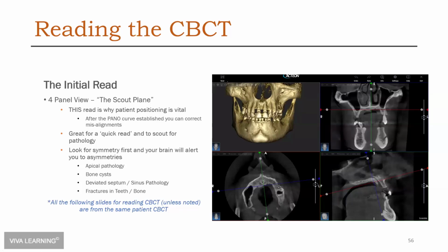This is a really nice one to read. And what I'm looking for essentially is, I'm in my office or I'm in the hallway before I've met the patient. I just want to do a quick scan to know kind of what I'm walking into. Okay, am I walking into a heavy caries case, a perio case, an edentulous case, a terminal case, a pathology case? You know, that's what we want to know.